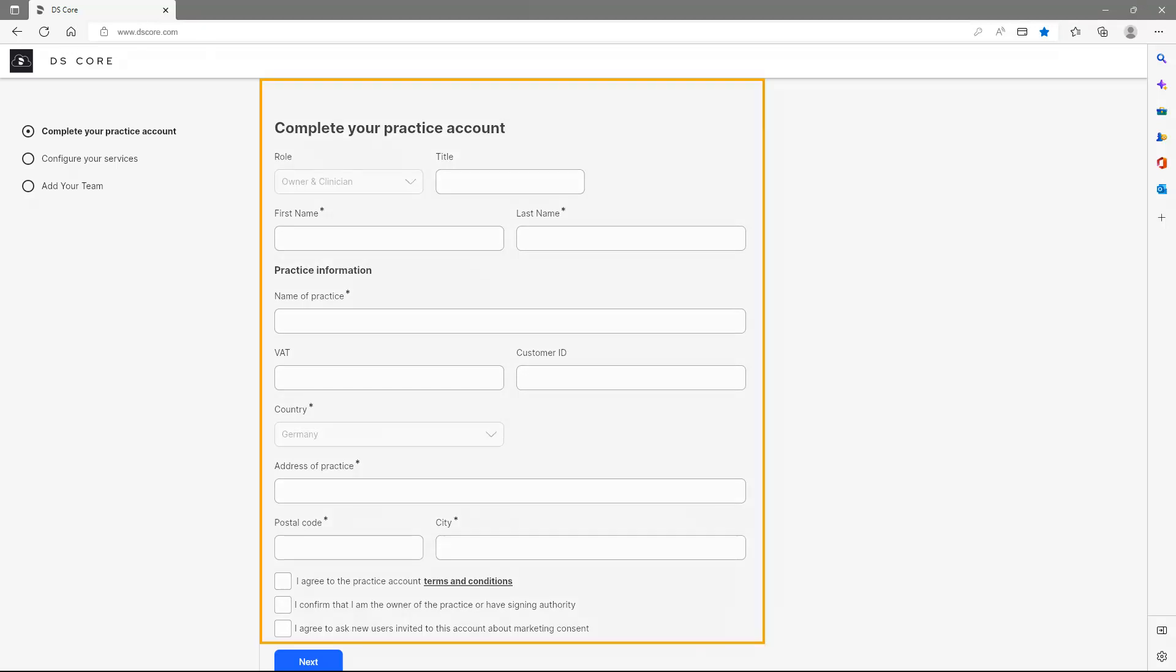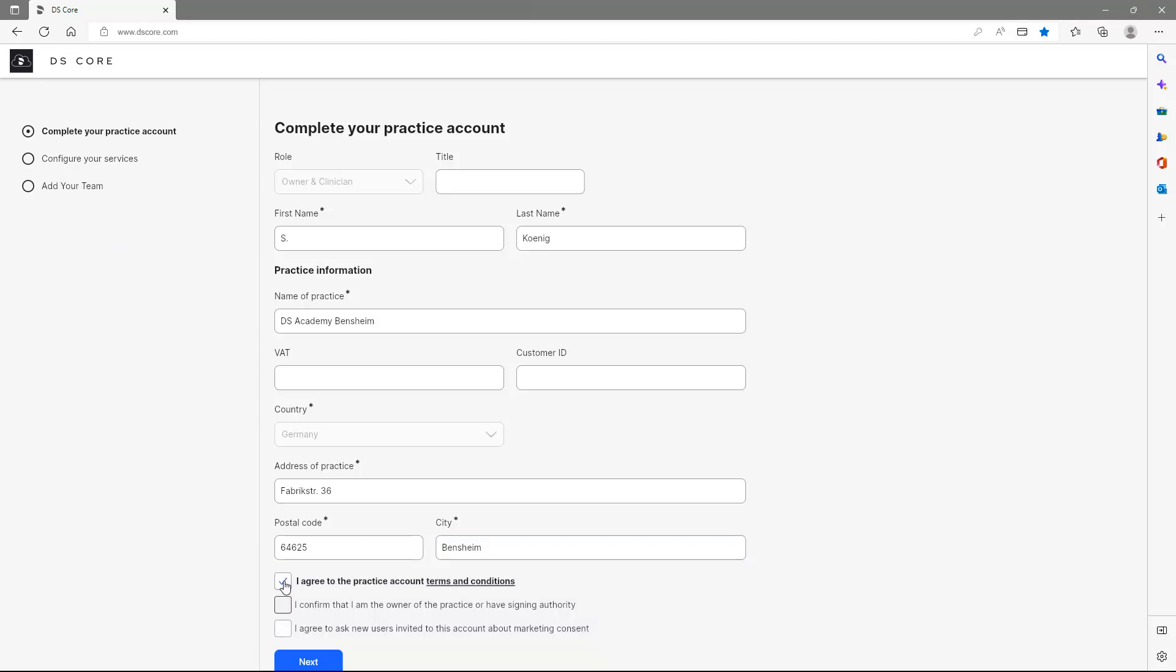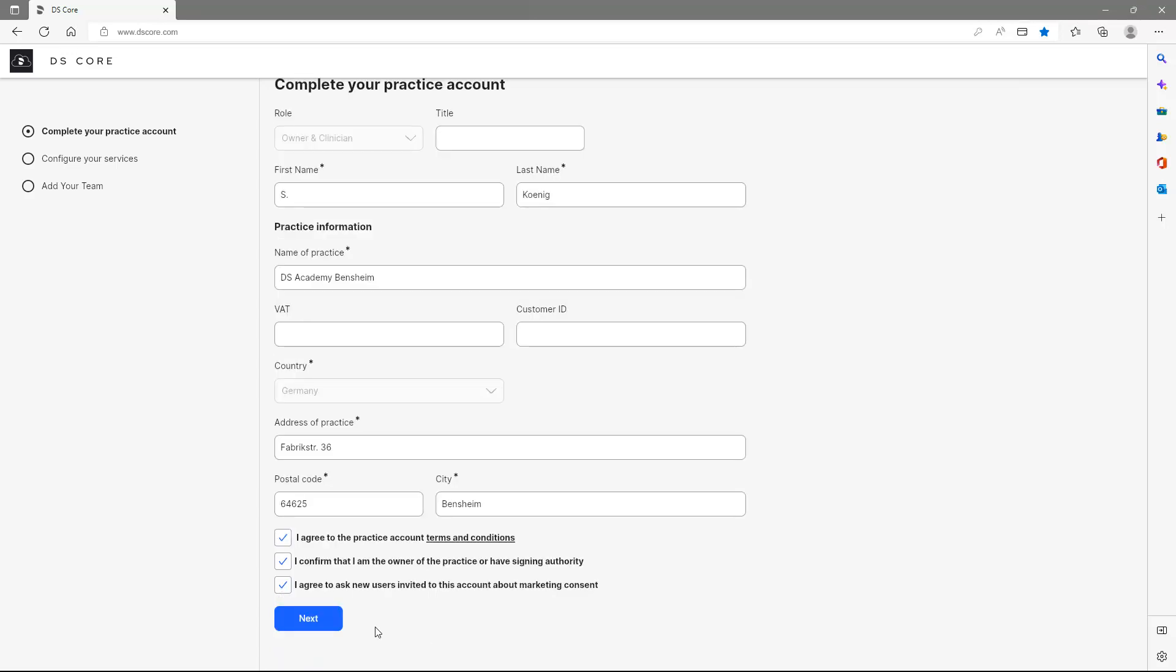First, we enter our practice information. Then, we place three checkmarks confirming Terms and Conditions, Ownership for Practice, and optionally, Marketing Consent. To continue, we tap Next.